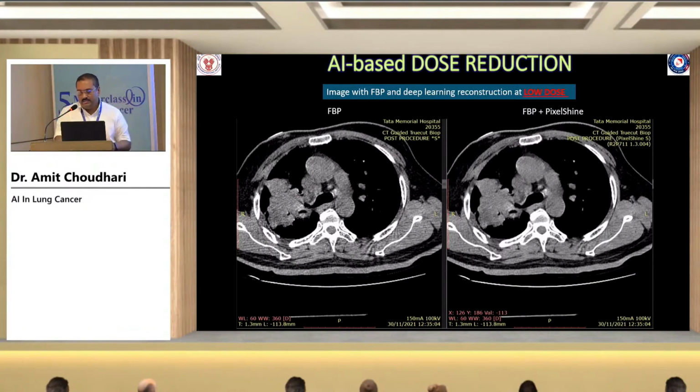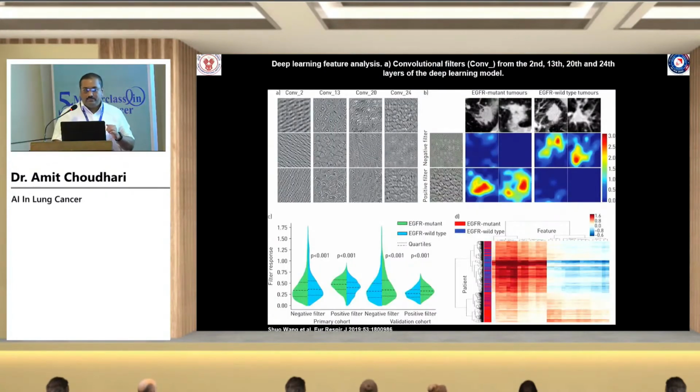As emphasized by Dr. Kunal in his talk, it is quite pertinent to have low dose, that is low kV, low mAs CTs, especially in biopsy studies, because we know that these studies have certain degree of radiation exposures, which by means of stochastic effect can lead to accumulation of the dose and can have certain hazardous effects like second cancers or even hereditary changes and mutation.